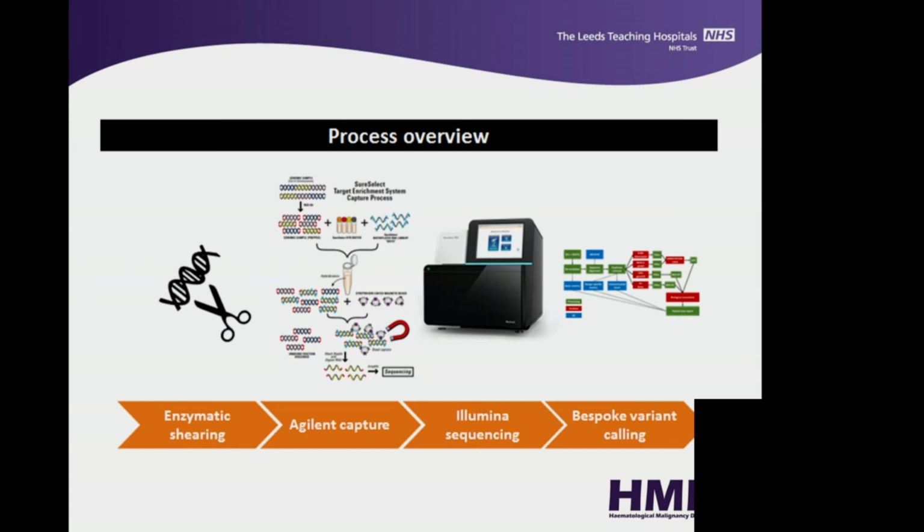We're going to use a fragmentation enzyme. This is a completely non-biased fragmentation enzyme. There are a couple on the market. Agilent make one, New England Biolabs make one. This is a non-biased way of cleaving your DNA. The other advantage is that it also makes it applicable for paraffin-embedded material.